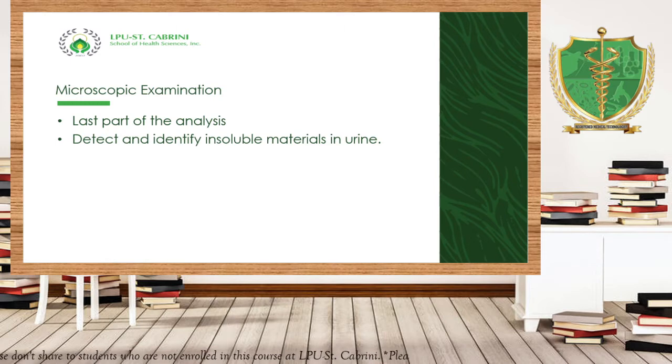From the word itself, microscopic examination, it means we are using the aid of the microscope in order for us to visualize, to detect, and identify the insoluble materials in the urine. Because the soluble materials contain chemicals that can be assessed, no, in our chemical analysis.